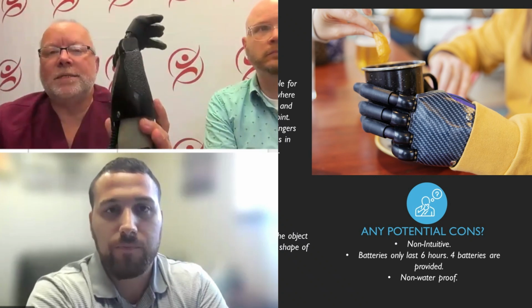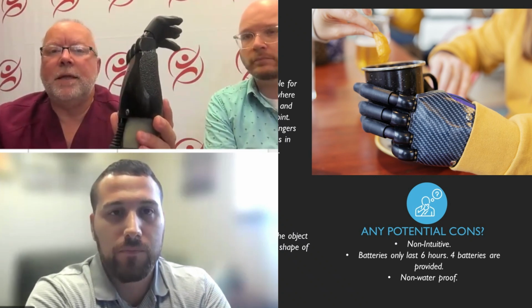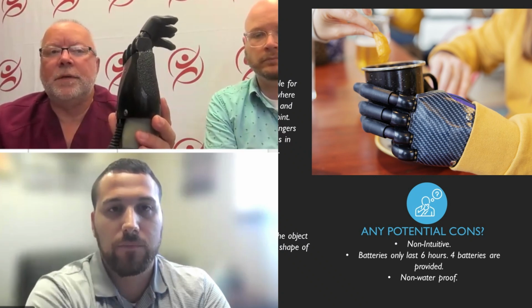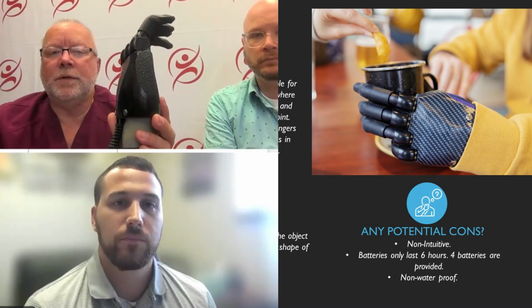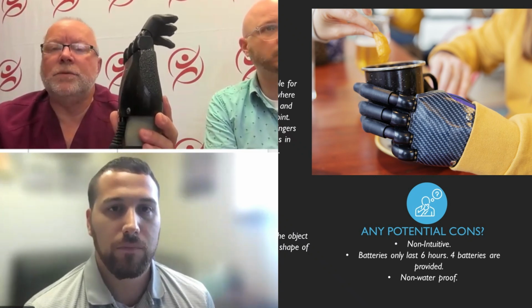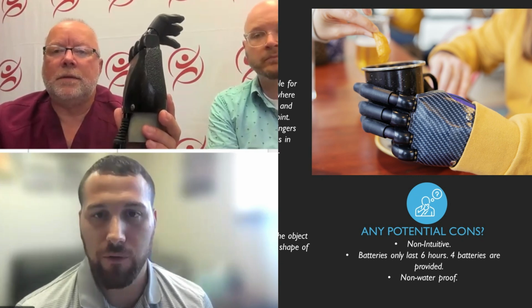And we would also send somebody to pre-prosthetic training for this too, because it helps whenever the day of delivery comes. It will help the patient with being able to open and close this. And then we would send them back after they get the device too. So that's part of the evaluation as well. That was on that slide.